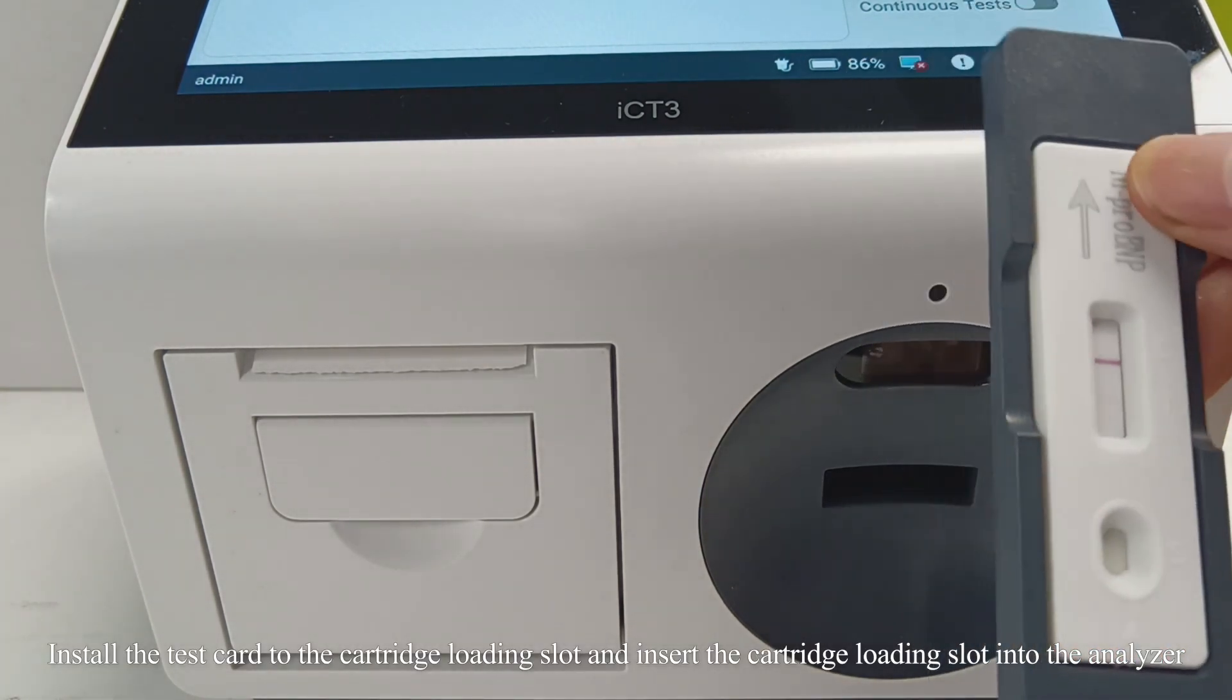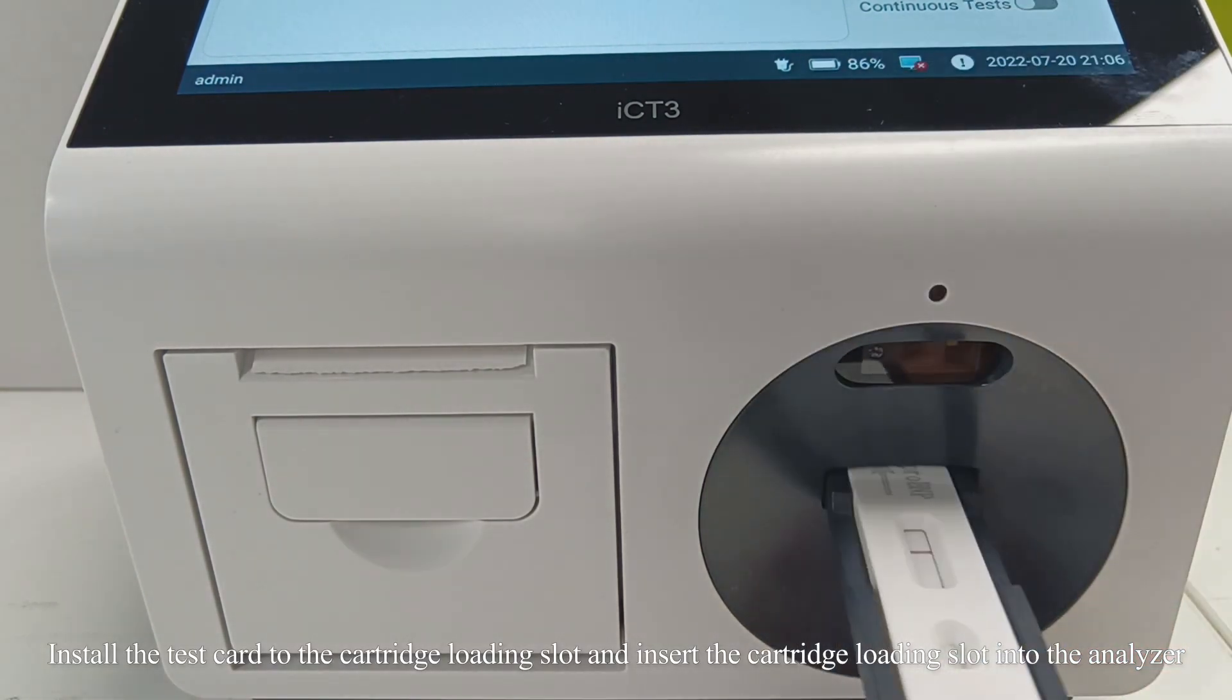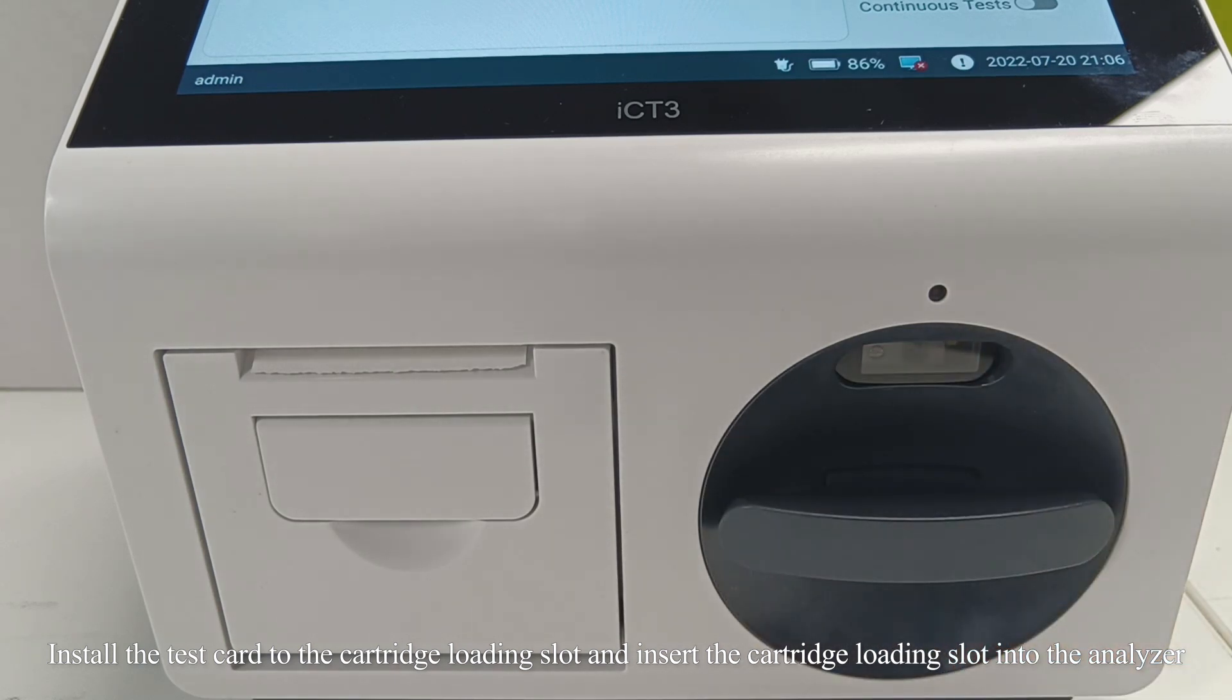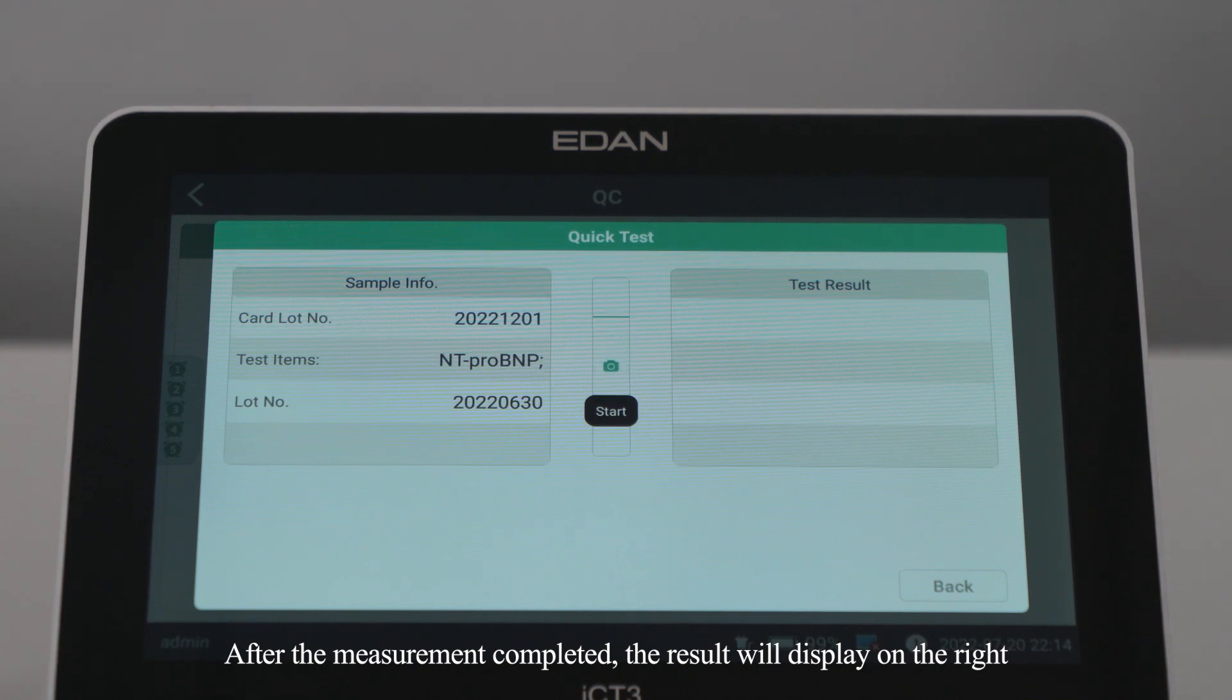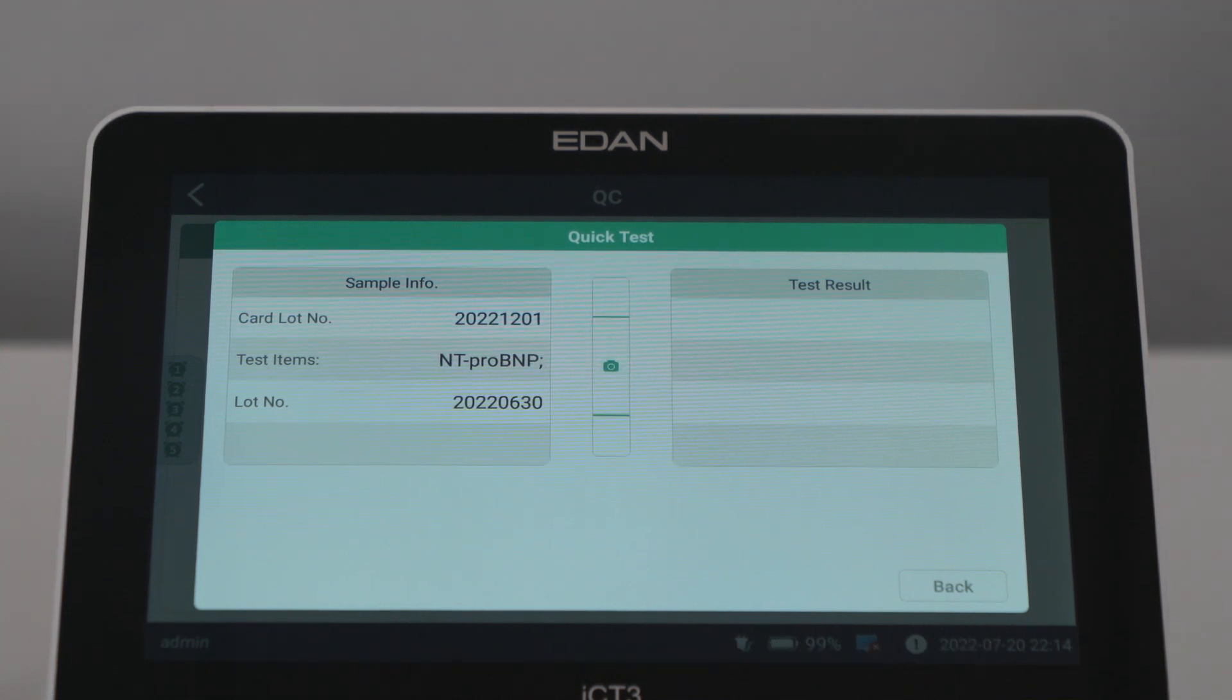Install the test card to the cartridge loading slot and insert the cartridge loading slot into the analyzer. Press quick test button. After the measurement completed, the result will display on the right.